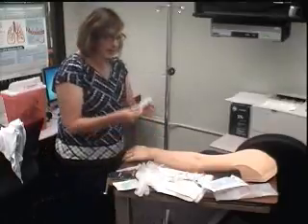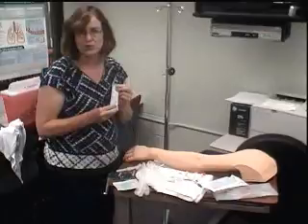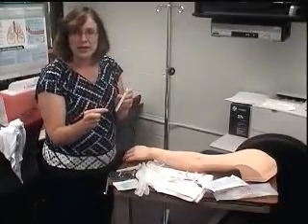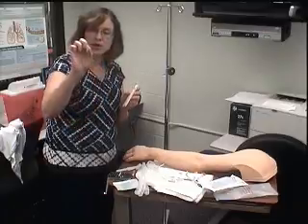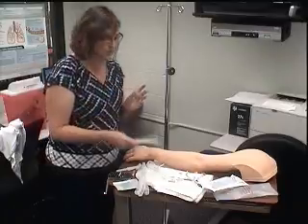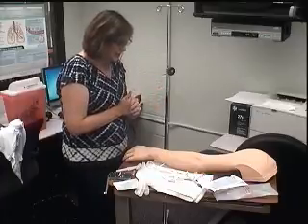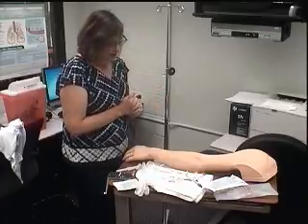By the way, when we speak of gauge, it's kind of like what we did with needles before when we gave IM injections. It's opposite of what you think it is. So an 18 gauge is bigger, thicker than a 20. So 22 is smaller. Okay, so 20 is kind of in the middle. It's a good one. We typically use a lot for adults.